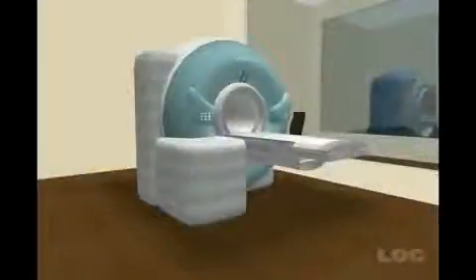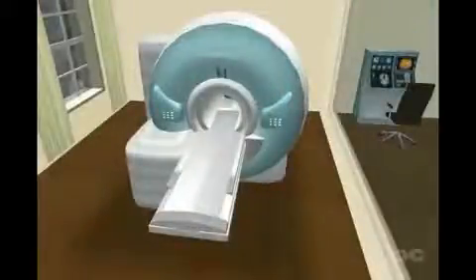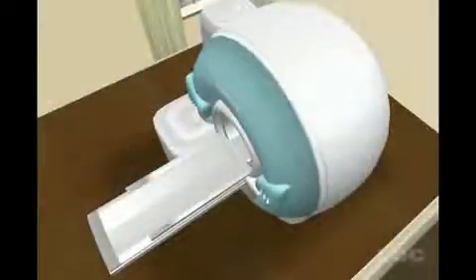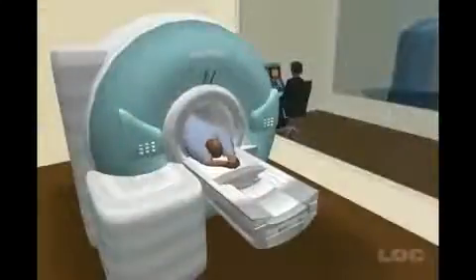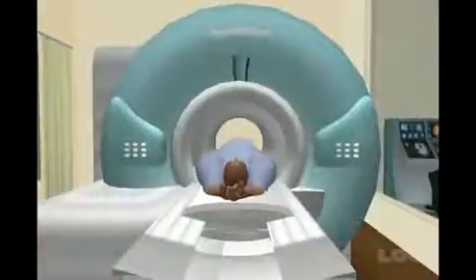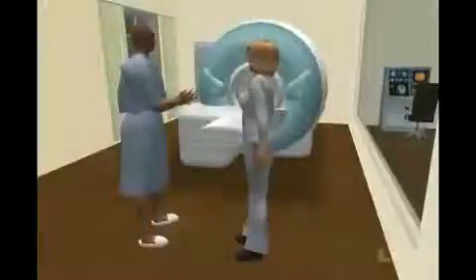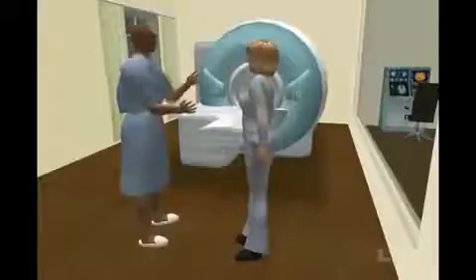A more recent innovation is the MRI scan. An MRI scan uses magnetism to build up a three-dimensional image of the inside of the body. Like the CT scanner, the MRI scanner also consists of a moving couch. This slowly moves a person through a cylinder that can be quite narrow, and some people find that this gives them a feeling of claustrophobia. There are a few open MRI scanners available for patients who suffer from claustrophobia, which reduce this tunnel effect.